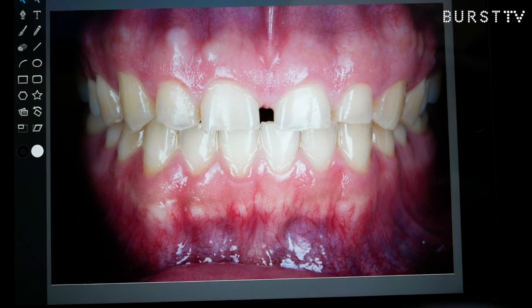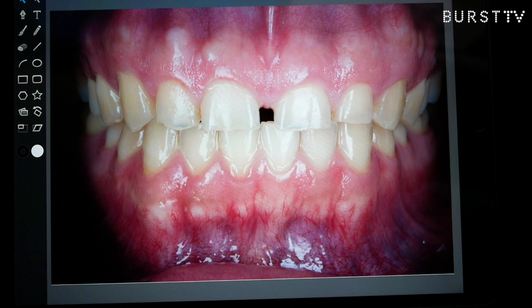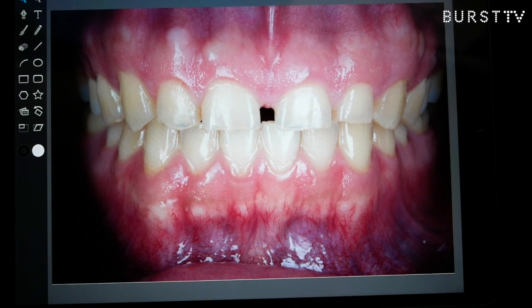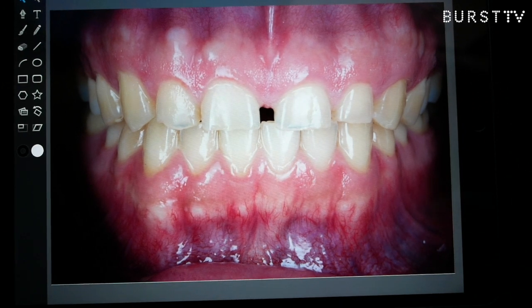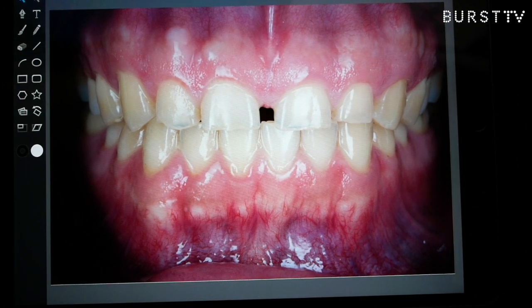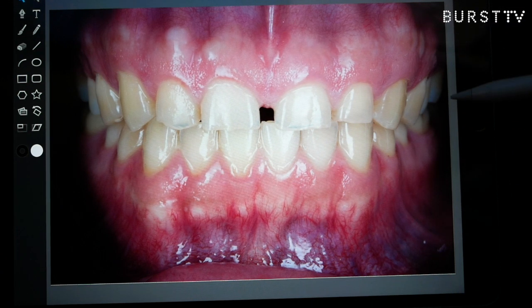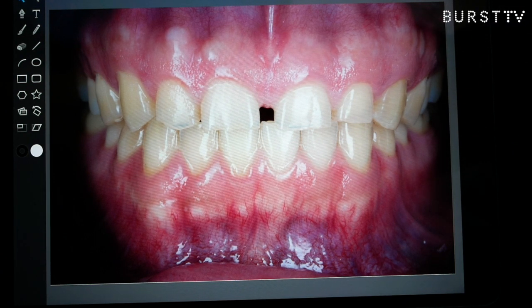So today, I want to talk about smile design and my thought process and how I do things here. So here's the case of a patient — cheek retracted, patient biting down.